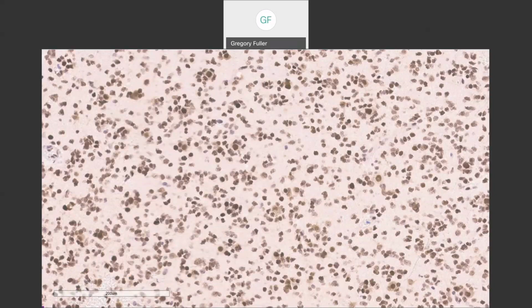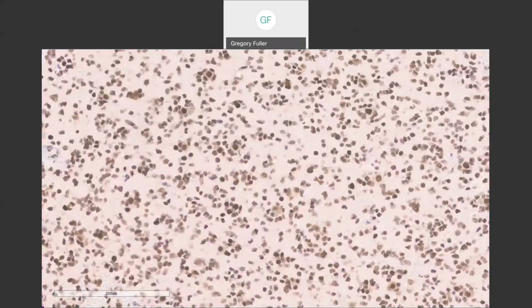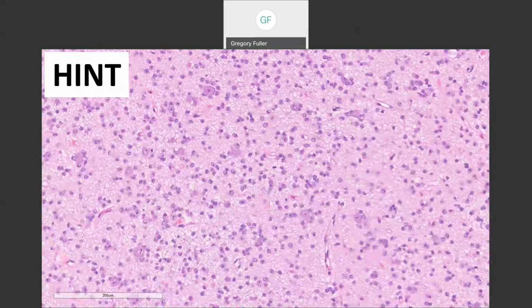How can you tell from the pattern, the morphologic pattern? In the cortex. That's right, Dr. Gilbert, or maybe the basal ganglia, maybe the thalamus. All right? Why don't we say gray matter? Here was the hint. This is the H&E of that same field, or a similar adjacent field. And what you're seeing, all these things in the center, and let's go back. And now, having seen, all right, let's go back. Let's look at the H&E. Do you see the second cellular constituent, the big guys that are standing out?